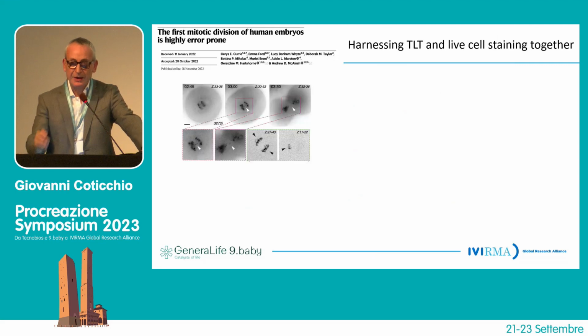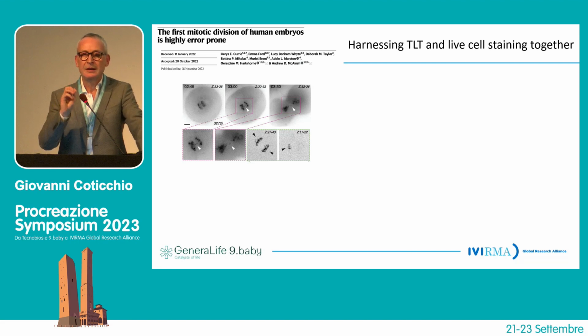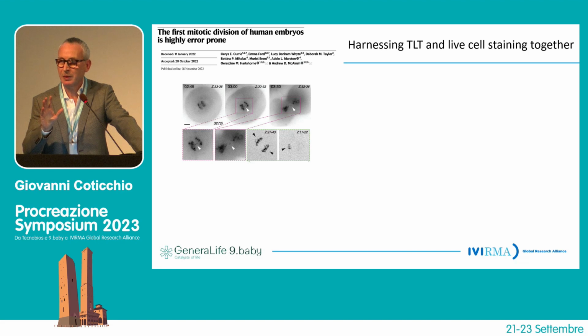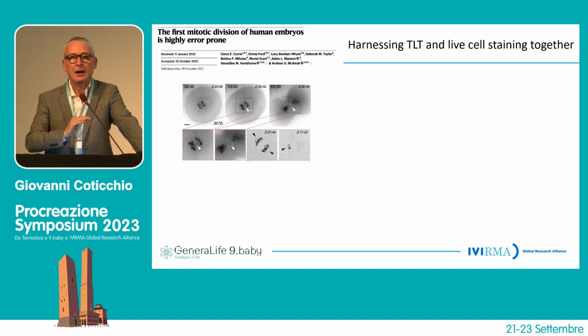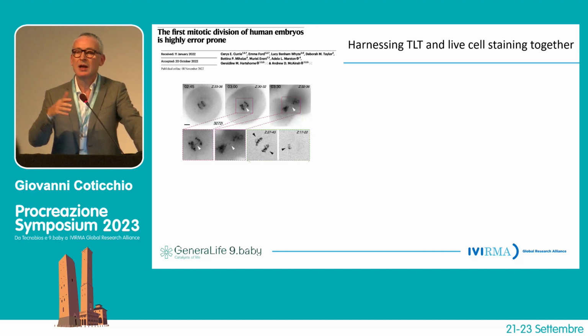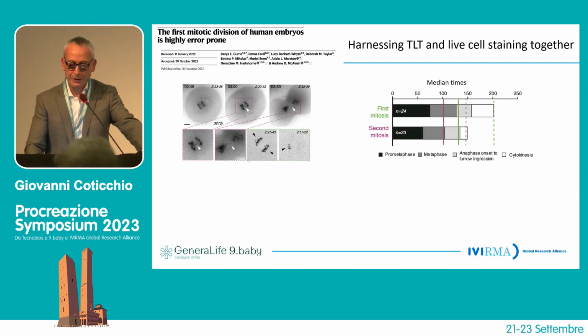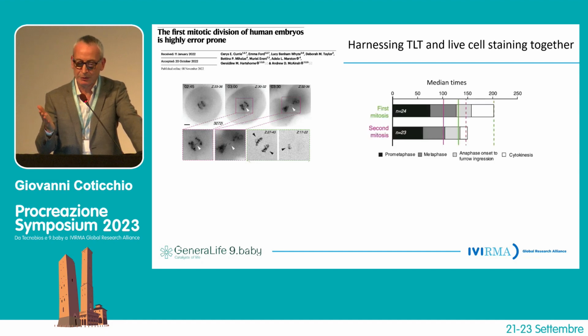Now, this story of the first mitotic cleavage is very interesting because the more we observe this stage of development, the more we find out how critical it is for the entire development. This study was published last year and again combined time-lapse technology with the fluorescent microscopy. And what the authors did was to follow the actual movement of chromosomes after pronuclear breakdown. And they observed a number of situations in which chromosomes were not being captured by the mitotic spindle, as I showed before. And they came to some interesting conclusions.